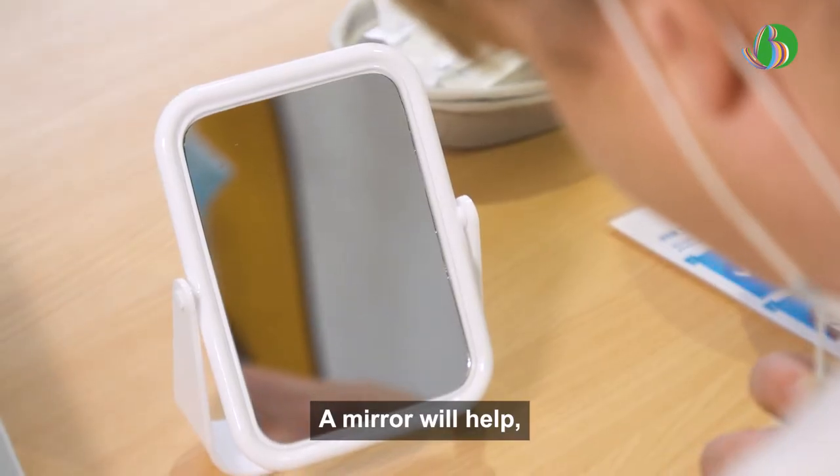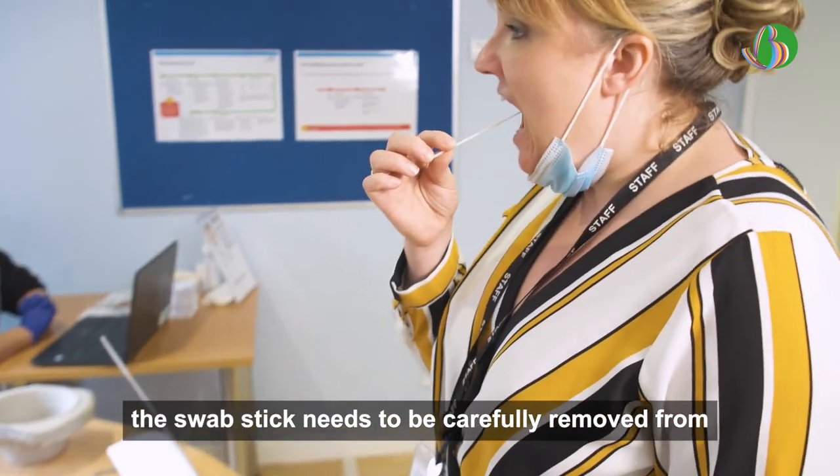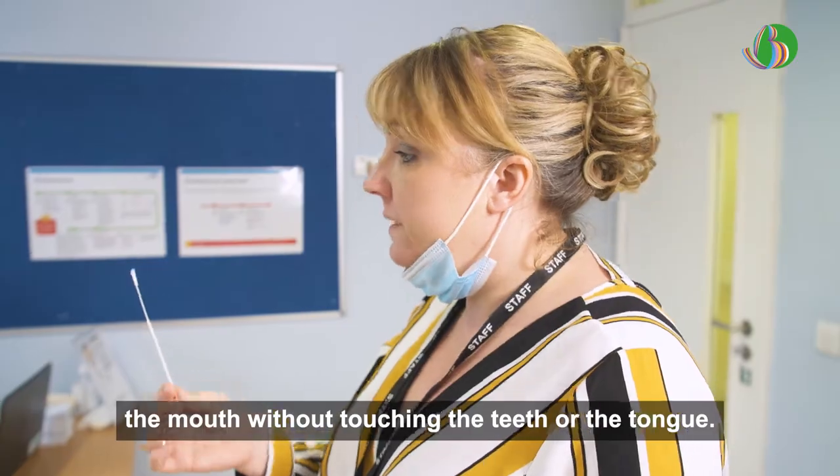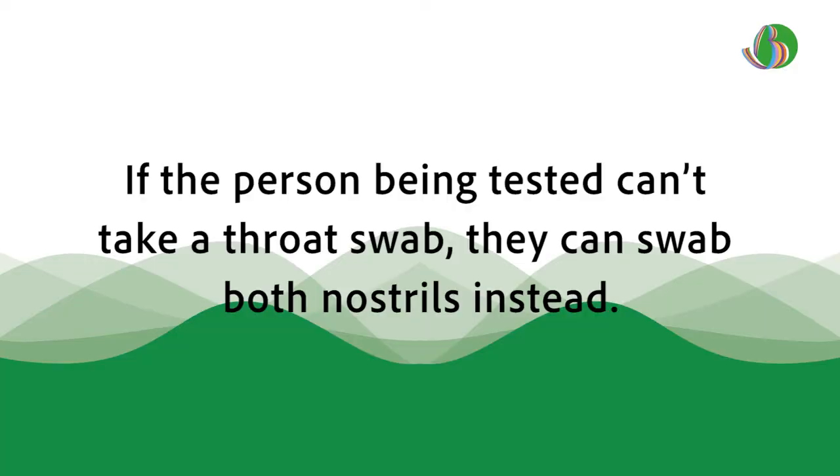A mirror will help. The swab stick needs to be carefully removed from the mouth without touching the teeth or the tongue. If the person being tested can't take a throat swab, they can swab both nostrils instead.